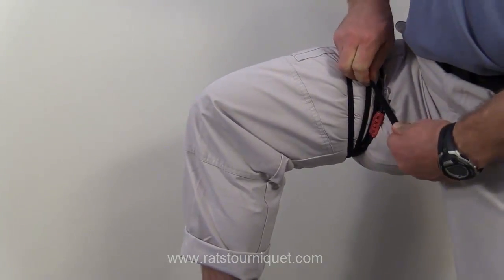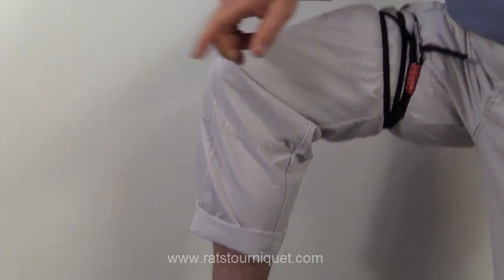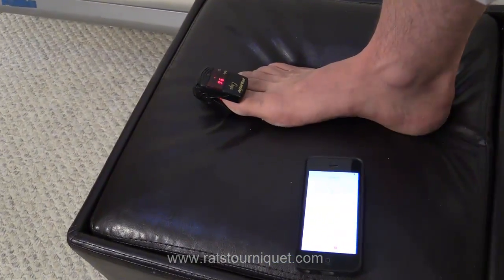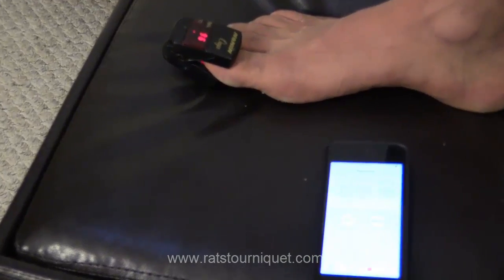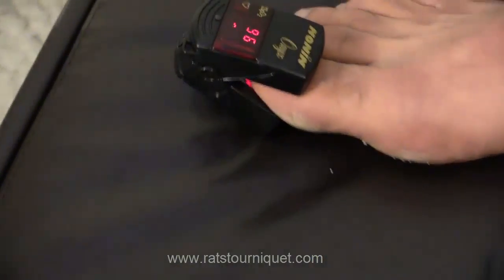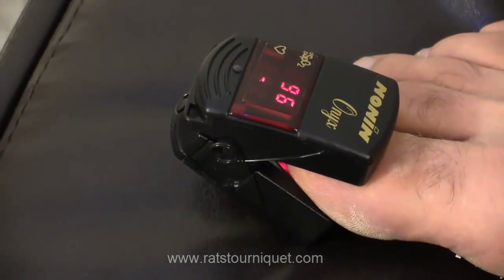When you reach the end, cleat off, and you can see that the pulse has already stopped on the end of my foot, so we don't even need to hit the start and stop time. The oxygen is the residual blood that's left in my leg, and that will shut down in the next few seconds.